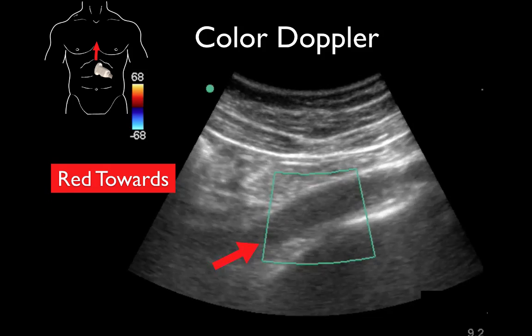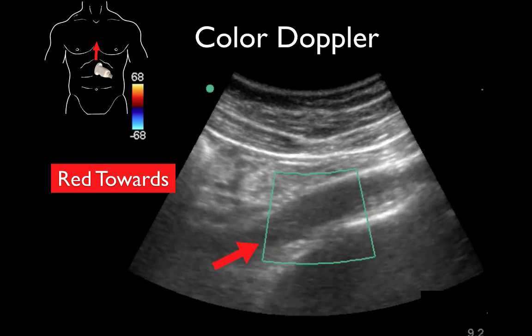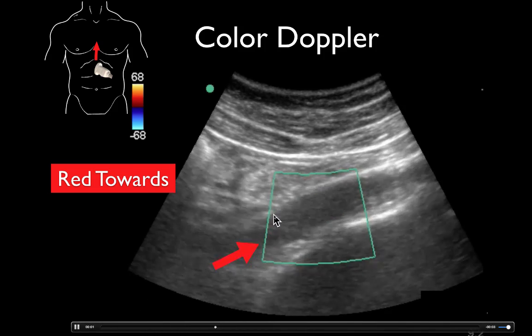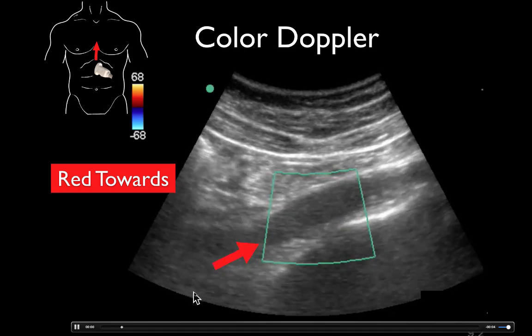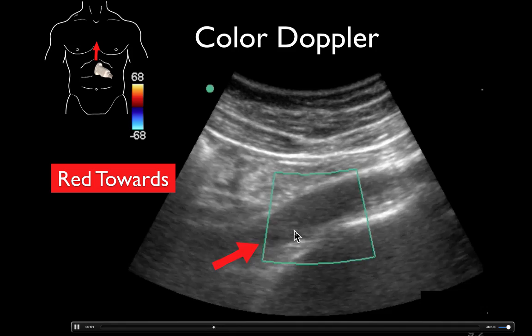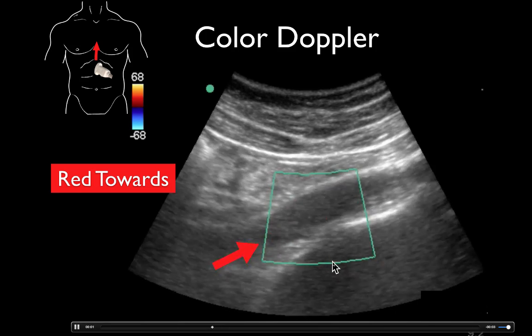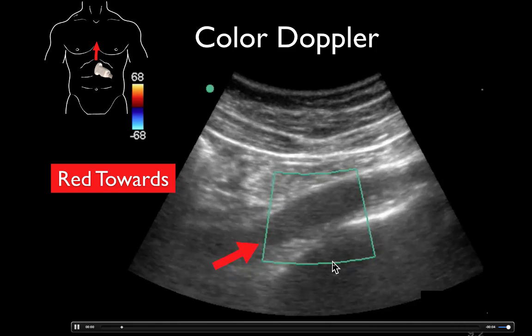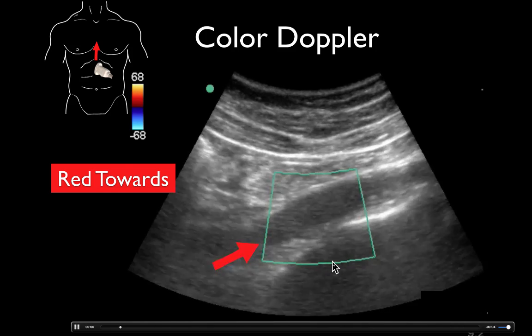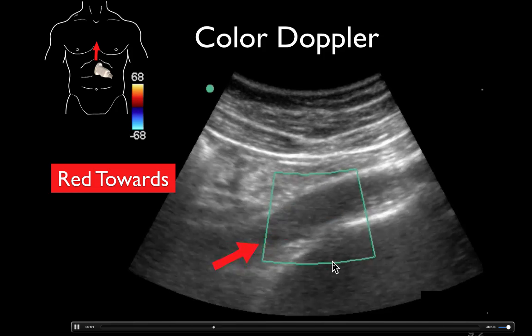In this example, we're on the exact same patient, but instead of angling toward the feet, we've angled the probe up toward the head. Now the aorta is coming toward us, and we see red color within the vessel. This is the exact same aorta. Remember, vessels do not light up one color or the other — it depends entirely on whether the blood flow is coming toward or away from the probe. Before we saw it in blue, now we're seeing it in red.